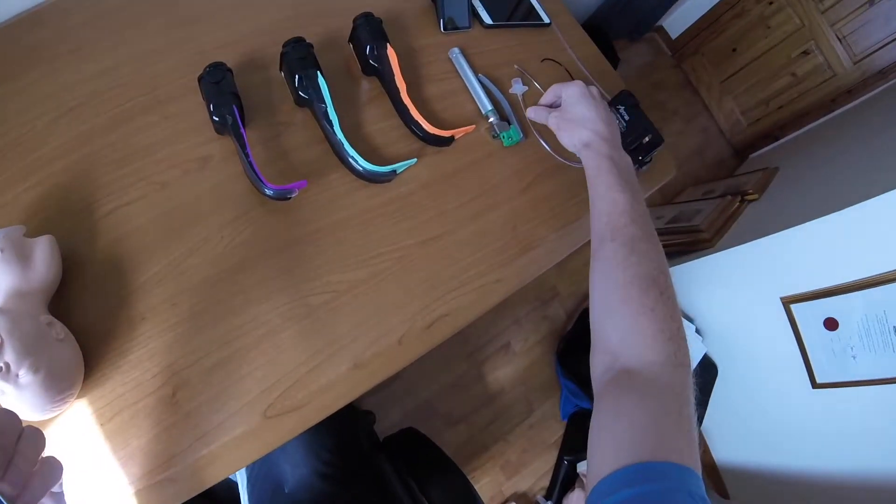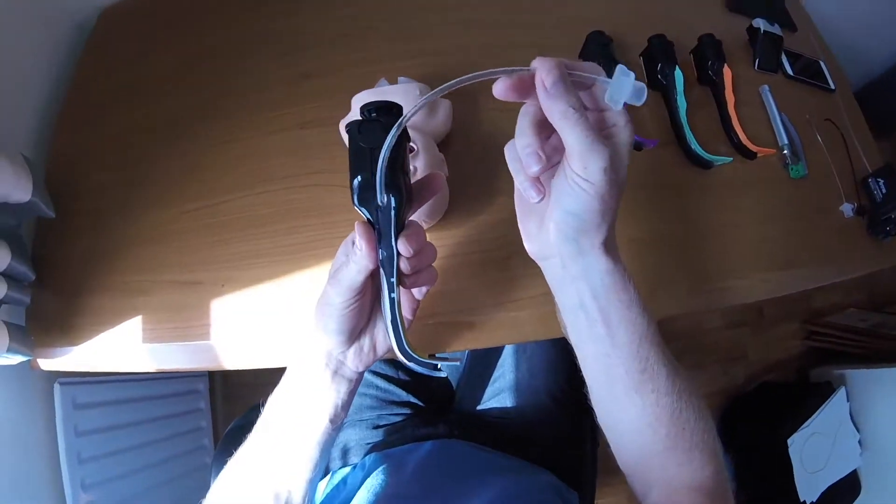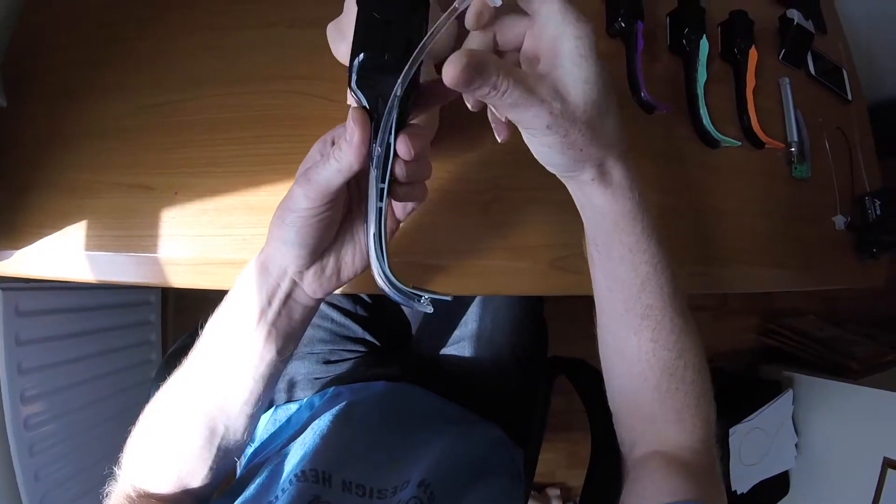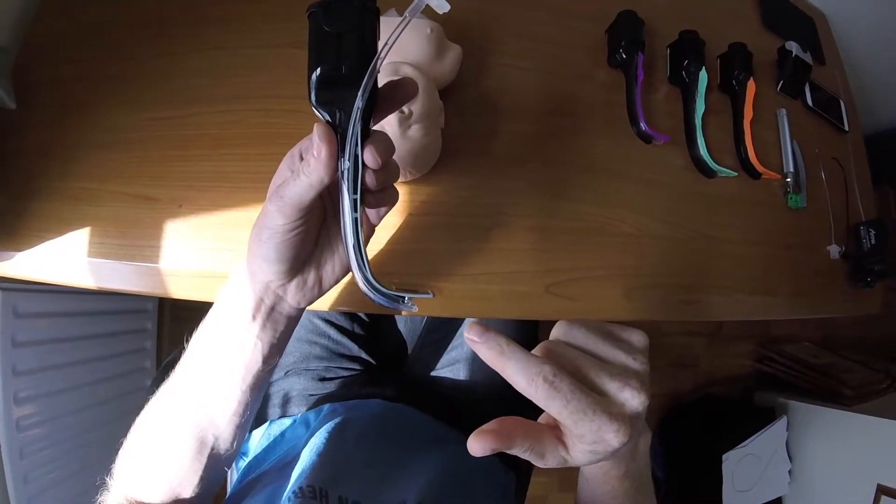Next, you need to load the endotracheal tube into the Airtrack. Load it into the side here and leave it so the tip isn't sticking out the end.